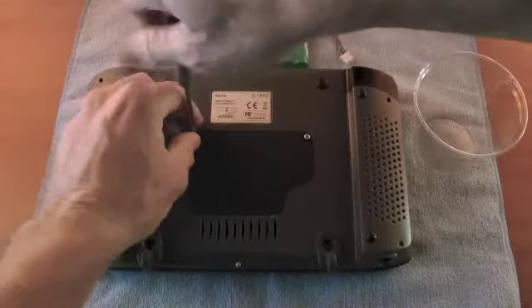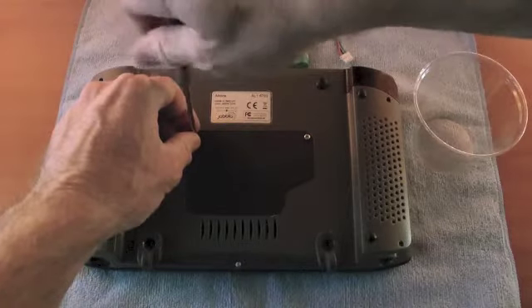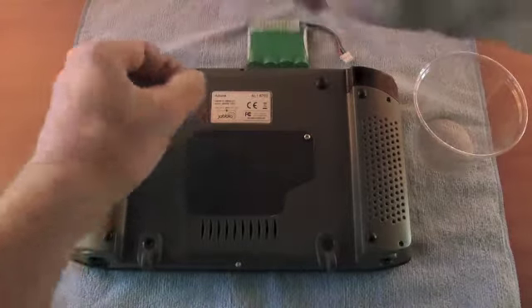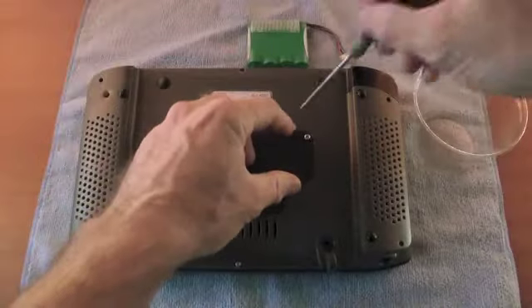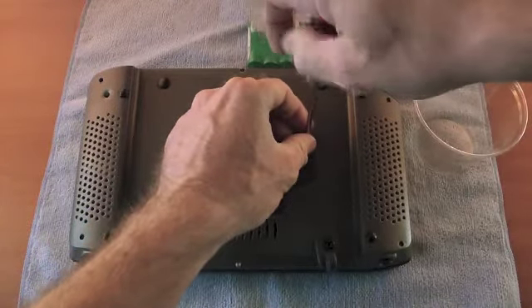Using the Phillips head screwdriver, remove the 2 battery cover screws. If your Allura does not have a battery cover, it is an older model and will need to be sent into a Jabbla authorized dealer to have the battery replaced.